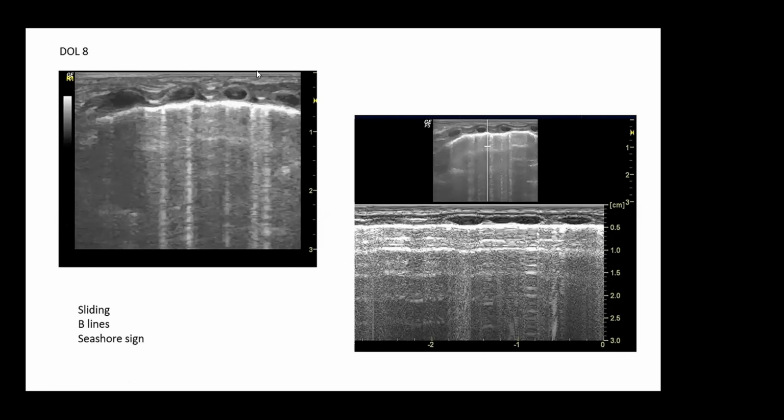I had Zahreddin also raise his hand. Zahreddin, did you have a question? A quick one, look, thank you so much. What is the medical legal stand on chest X-ray versus ultrasound to prove a pneumothorax?